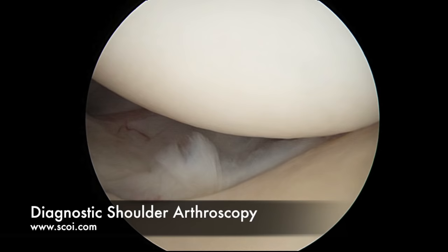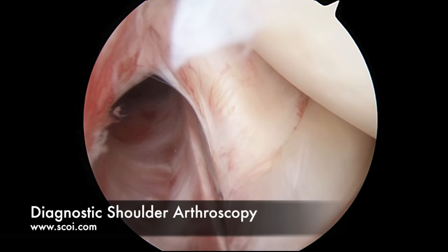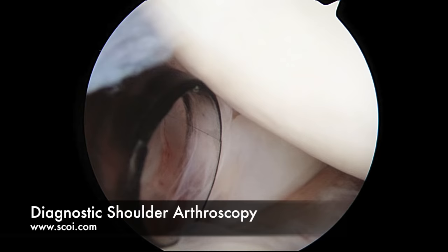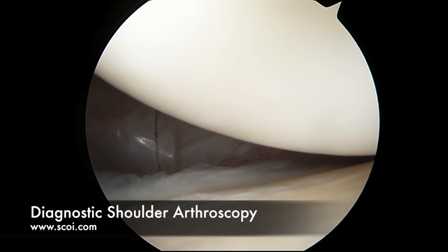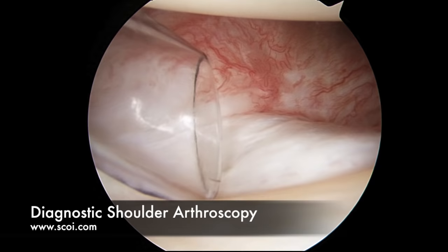Anteriorly is next. The anterior labrum in front of the biceps looks just fine. Behind that is the subscapularis muscle, which helps you internally rotate your arm and get it up the back of your spine. Coming down anteriorly along the anterior labrum, this is all intact. If you tear these ligaments here, the shoulder is more likely to dislocate. People that dislocate their shoulders tend to have a detached labrum anteriorly in the shoulder.